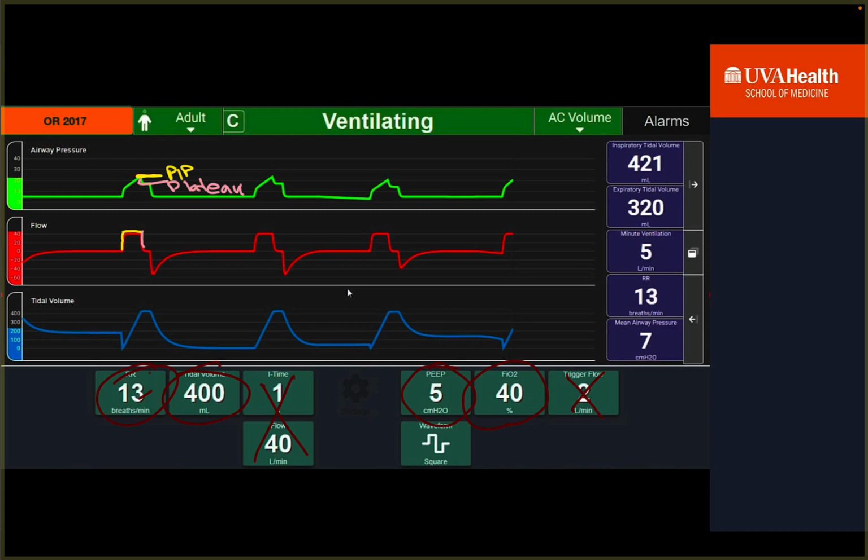Similarly, looking at the actual volumes of the lung, there's a mechanical artifact where there's a slight dip in pressure in volume here, transiently at the beginning. But then the volume that is actually pushed into the circuit and patient's lungs increases steadily. Notice the volume pauses here, and that the pressure is actually dropping as this volume dissipates through the lung. You don't have to get heavily into this yet, but if you do the work that some of your faculty does every day, then this will be of great interest to you.